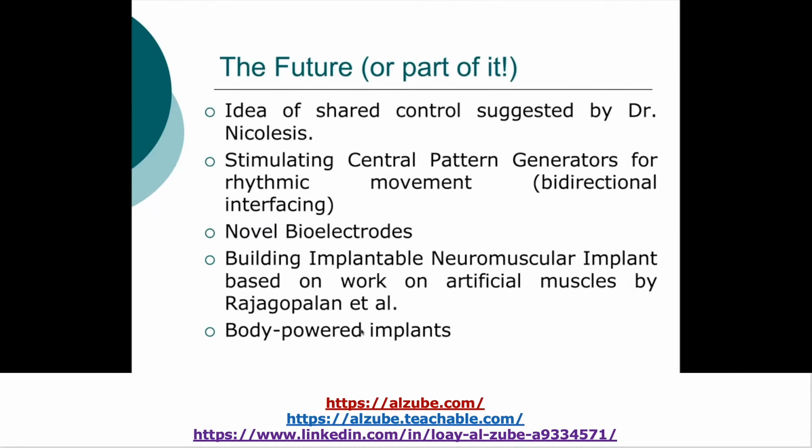We are trying to generate electrodes made from polymers, from plastics, mimicking electrical conduction by allowing ions to move in and out. So we're trying to create electrodes from polymers, not from metals. And the way that they conduct electricity is by allowing ions to move in and out, not electrons. And so there's a lot of research going on about this right now.